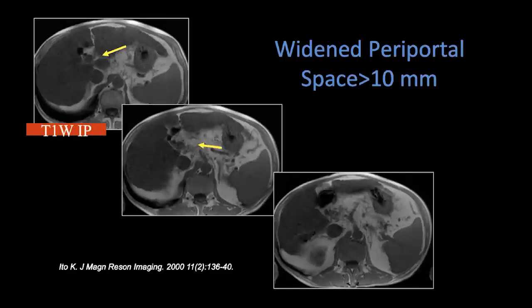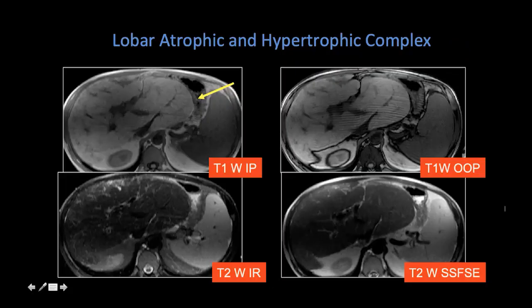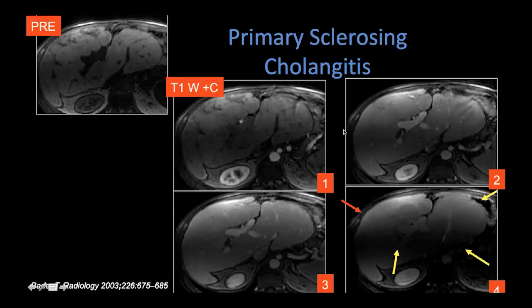Other features that one may see is widening of the periportal space by greater than 10 millimeters. One may also see the entire changes of lobar atrophic and hypertrophic complexes — here we have massive enlargement of the caudate lobe but relatively atrophic changes of the remainder of the liver. After infusion of contrast, this central hypertrophy is very classic in patients with sclerosing cholangitis or other biliary types of cirrhosis. The hypertrophic atrophic changes can be very helpful.